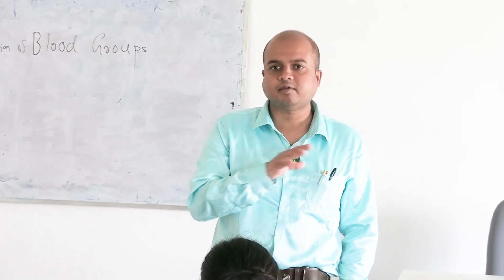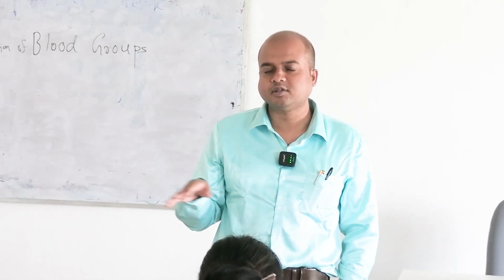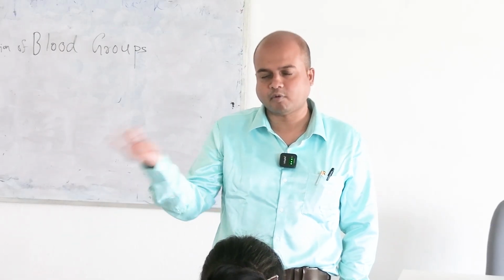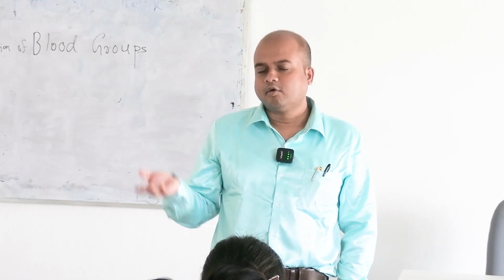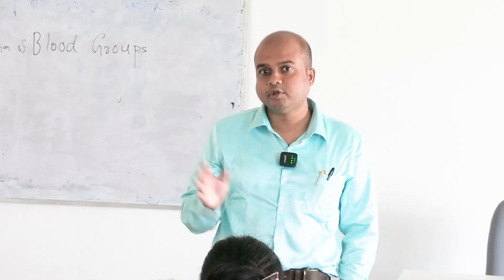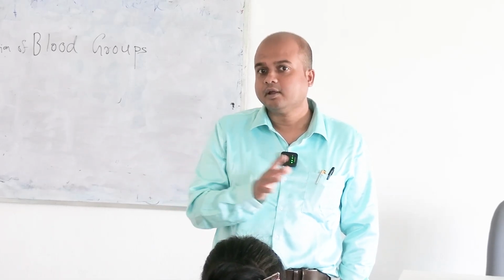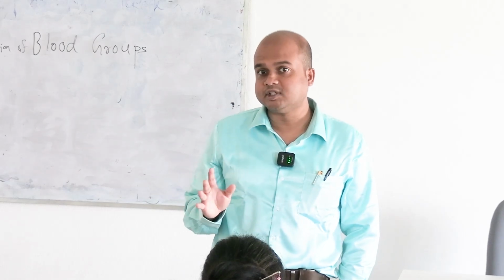There are various types of mismatching of blood during blood transfusion from one person to another, one blood type to another. If it is transfused, there may be various adverse effects. The most important one which we are to consider is for the ABO system.